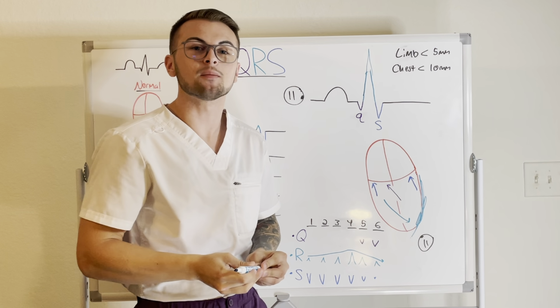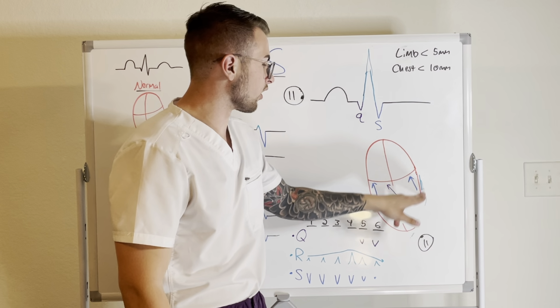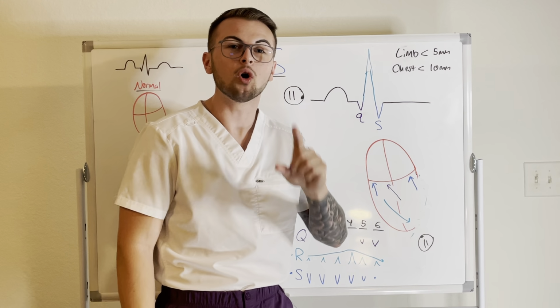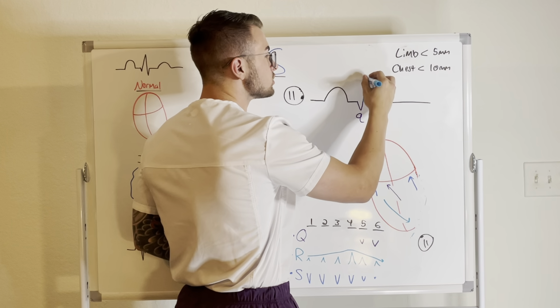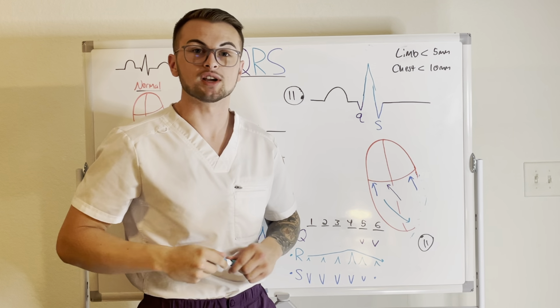Now, if we had some infarcted muscle or dead tissue, let's say that our ventricles become really weak, then this type of tissue, the scarred necrotic dead tissue, won't be able to generate electricity normally. Now, we will see a lessened or a smaller amplitude for our QRS complex on our EKG tracing.